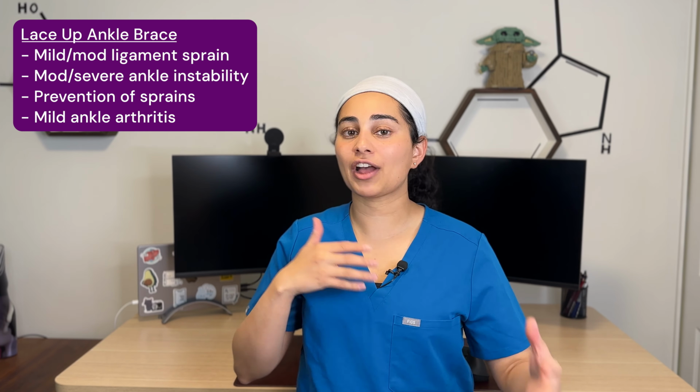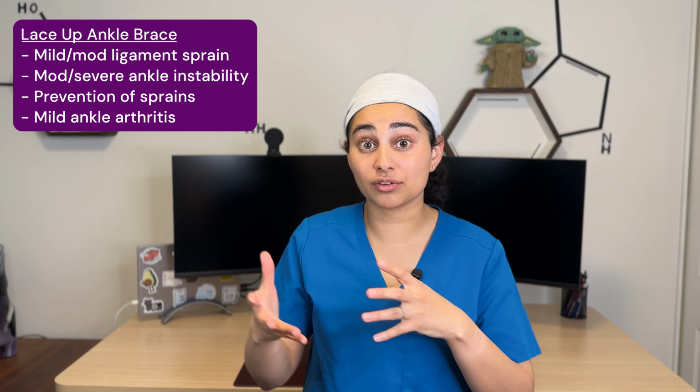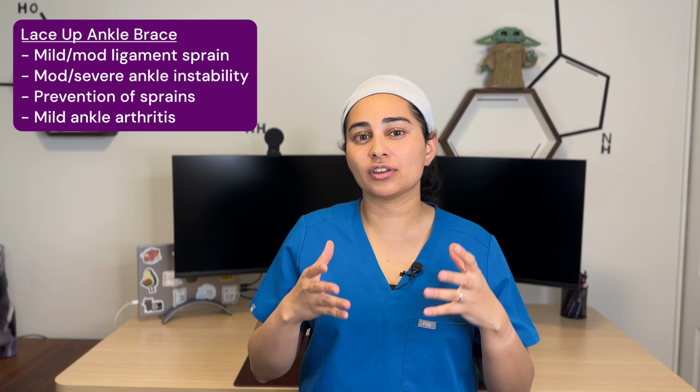But it is one of the more stable options for those who are, for example, playing basketball and who've had a prior ankle sprain and who want to avoid re-injury. It's also really helpful in those with moderate to severe ankle instability, and they need that added benefit of support when they're hiking, walking, moving, and patients need that support.